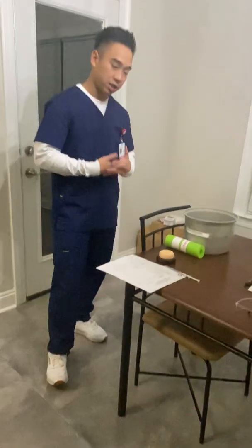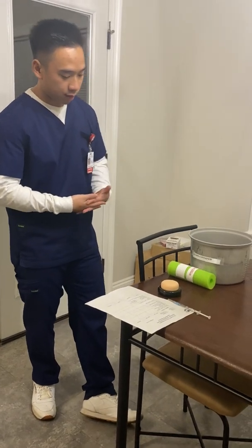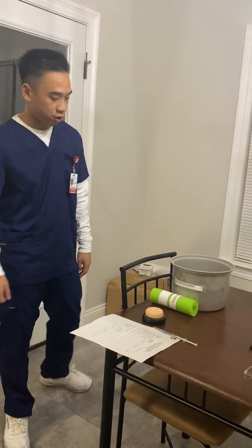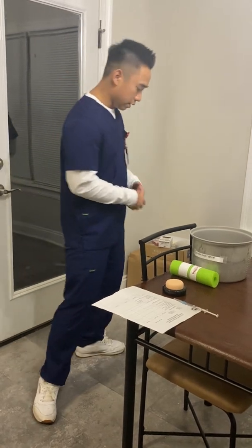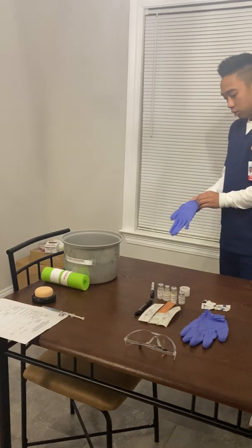After that, you're going to explain the procedure to the patient. So Mr. Jones, I'm going to be administering heparin subcutaneously on your abdomen. It's going to be a quick little procedure, should be over in no time. So after I do that, I'm going to lower or raise the bed to a good working height. I'm going to lower the side rail, and then I'm going to apply my clean gloves and goggles.